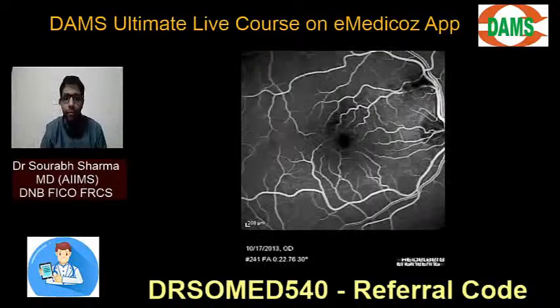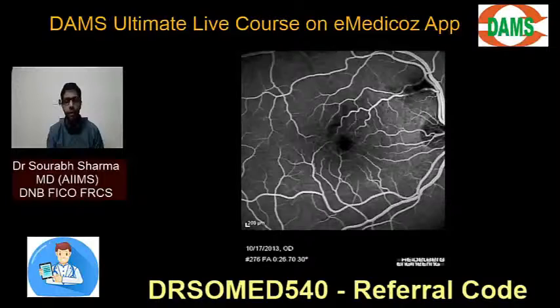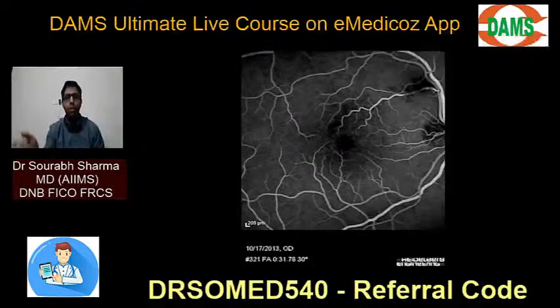Why first in choroid? Very good, Garima Bansal, because from the ophthalmic artery, the choroidal vessels have the route from the dye. The choroidal vessels are first, and then comes the central artery. The pathway, anatomy, the pathway from the ophthalmic artery is like that. First there will be dye, the blood goes into the choroidal vessels. That's why dye will also go into choroidal vessels first, and then central artery.